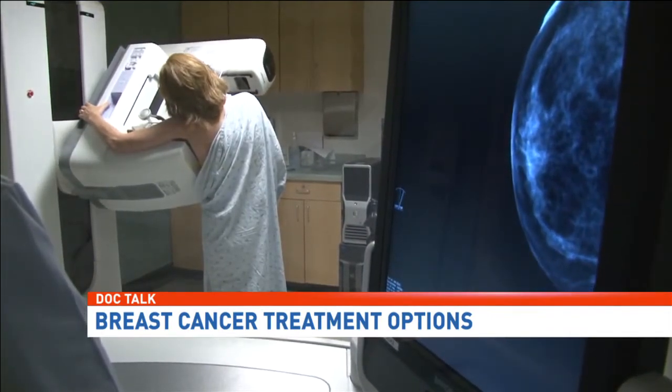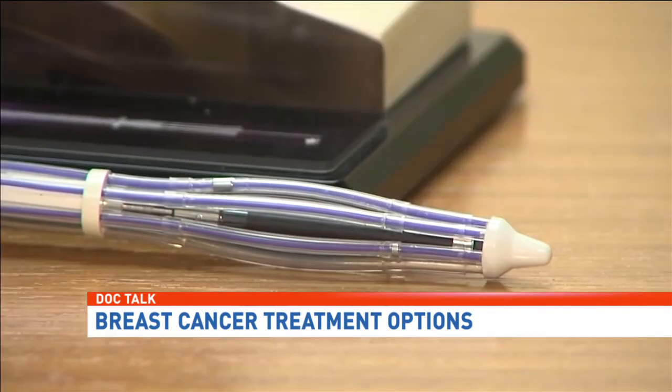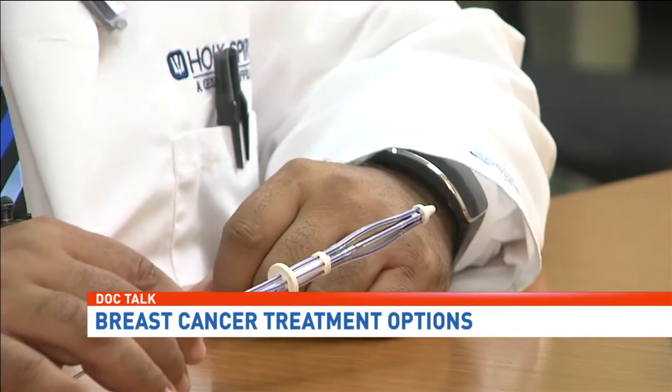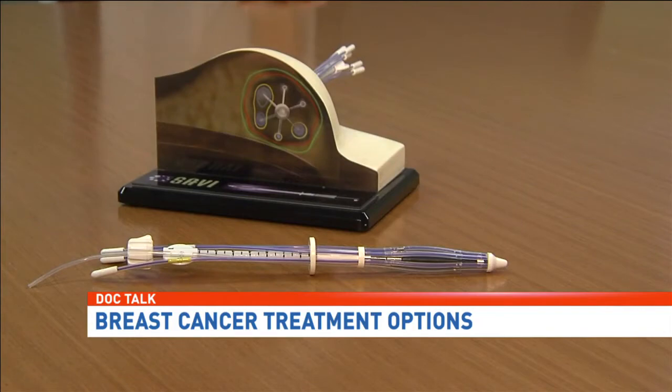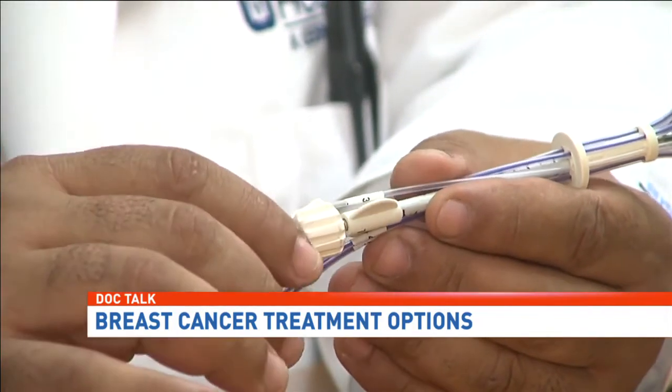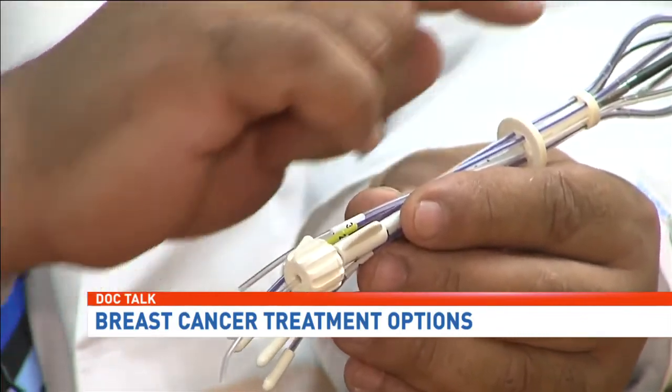just as effective. The studies had shown that the tumor control with this versus the whole breast radiation is the same. The implant is put in after surgery, in the breast cavity where the tumor was removed. It's inserted surgically. Once inside, it's inflated. These catheters are being connected later on to a special machine where the radiation goes through each one of them.